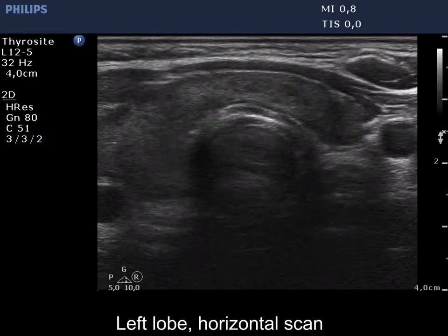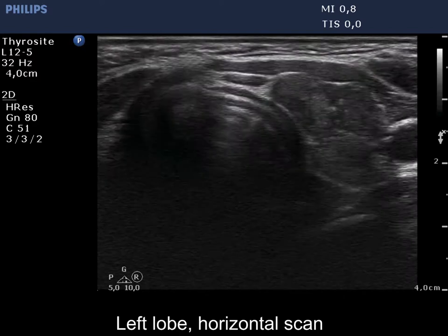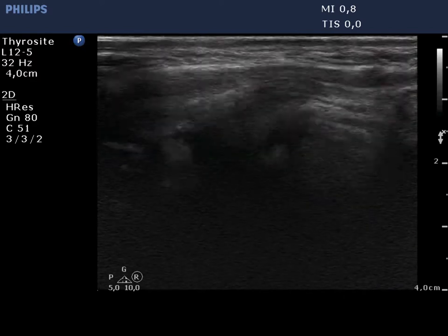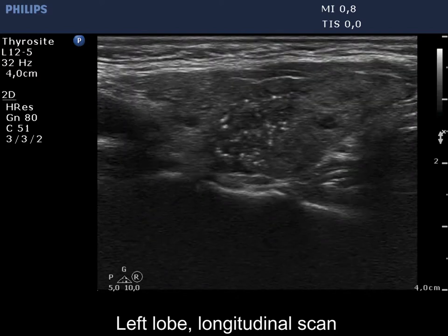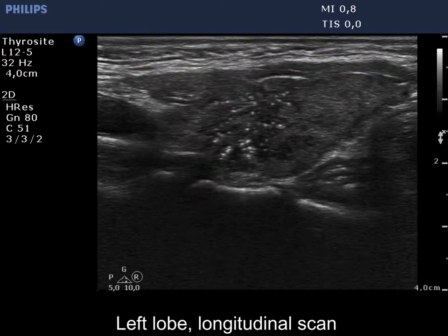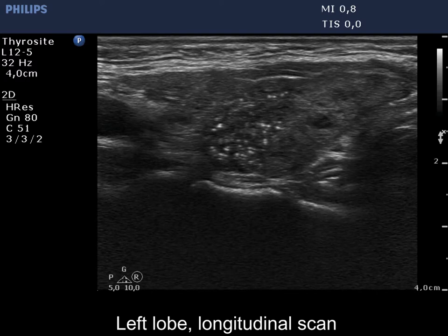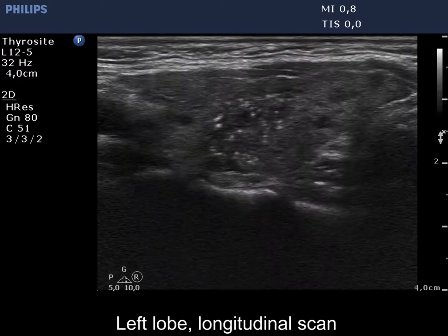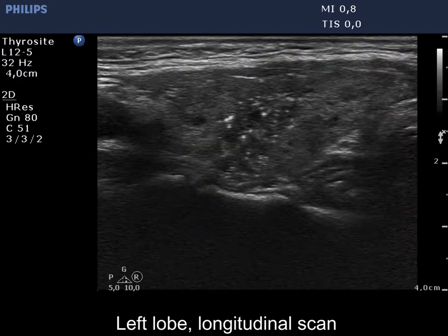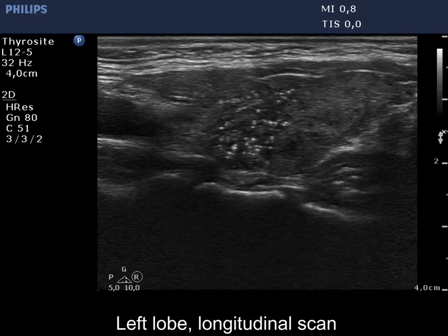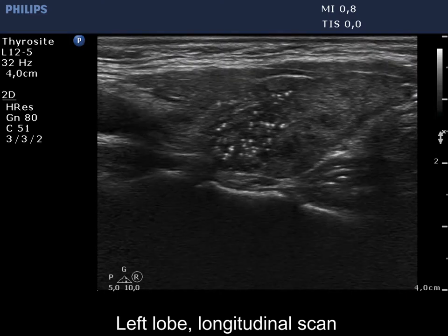The thyroid has numerous hypoechoic areas corresponding to thyroiditis. There is a deeply hypoechoic nodule which shows the so-called starry sky phenomenon. It is very difficult to clearly determine the borders of the nodule. This pattern is itself almost diagnostic for papillary cancer.